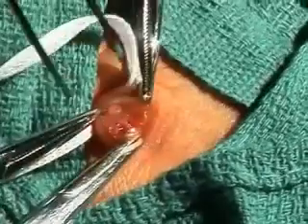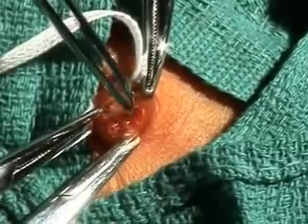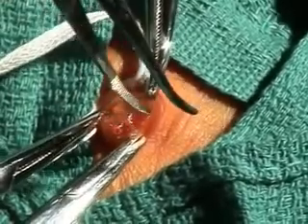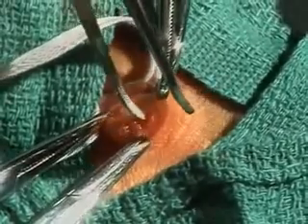Using your non-dominant hand, place the closed or pinched tip of the curved iris forceps into the lumen of the artery to a depth of approximately 0.5 centimeters. Keep the tip closed on initial insertion and then remove the forceps.